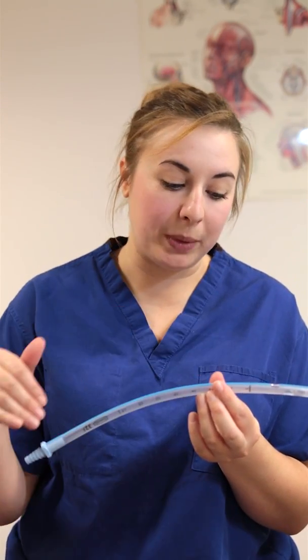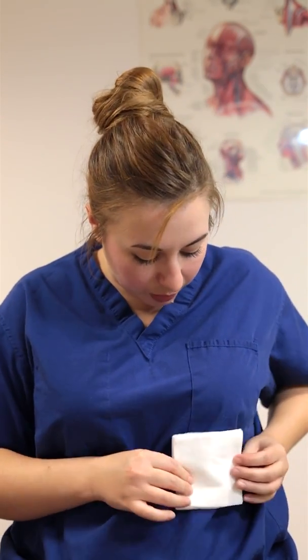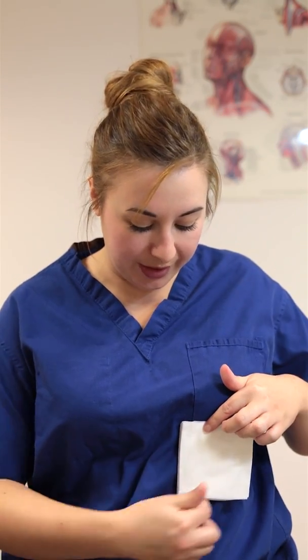If the drain comes completely dislodged — the sutures undo or it slips all the way out — and you have a patient with an open thoracostomy hole, a quick fix if you don't have a chest seal, a muscle seal, or an Asherman seal is to take a piece of gauze, place it over the chest, and tape down three sides with micropore, leaving one side open. As long as one side is free of tape it acts the same as a chest seal, allowing you to get back to your department safely and have a doctor reinsert a drain.